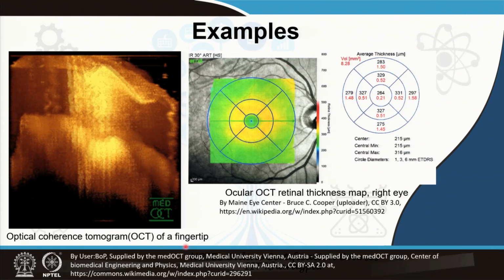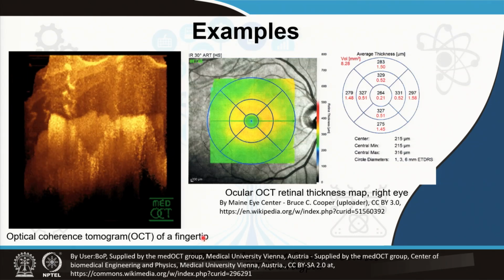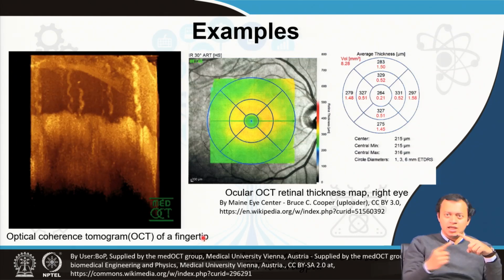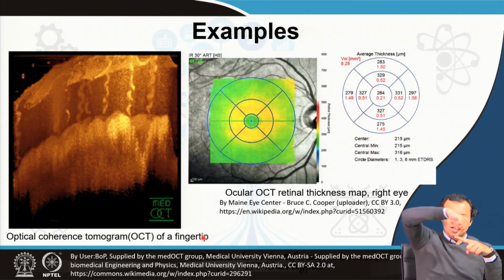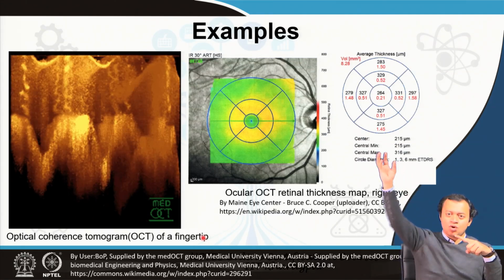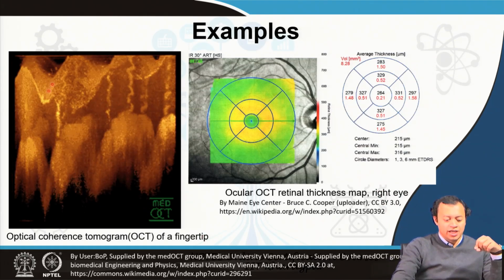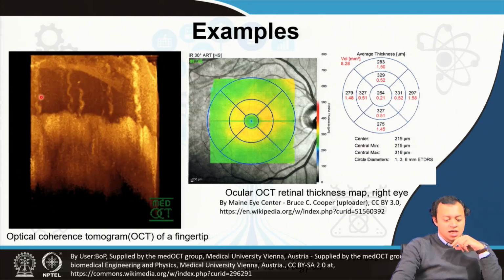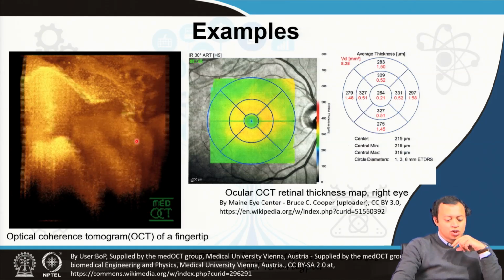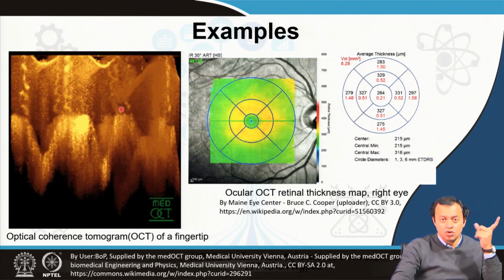This is the optical coherence tomography of a fingertip. So, you have put a finger, the fiber light has come in different directions, that has penetrated it differently, and that has been compared with the movement of the mirror, and you are overall getting the depth profile of your finger. These corkscrew-like structures you see, these are sweat glands in your finger.